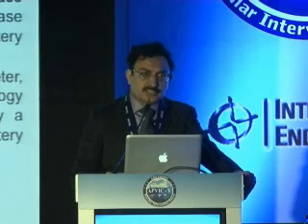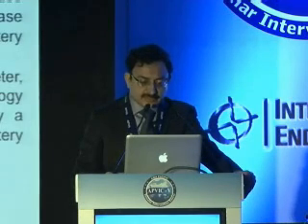This is another case where we had a renal artery stenosis. We dilated with a balloon, then put a renal artery stent. And it's very simple to do these procedures in just 5 to 6 minutes. Similarly, iliac lesions are very easy to cannulate and treat. Common femoral lesions are easy to treat.